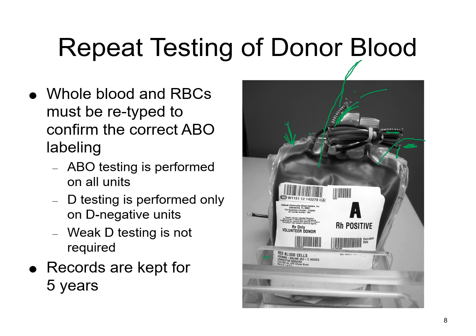The tube welder that we talked about in previous lectures, I think you had some videos on it, you may have had an assignment, will seal those off. You would go through, there are little marks on this tubing, and you would seal it off at those marks. That way each of these segments has that unique number on it, so that if this ever gets disconnected, because sometimes you can burn through these, it gives you a way to verify.